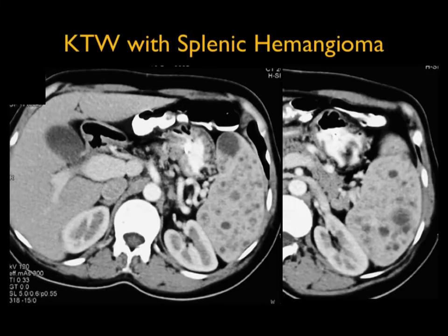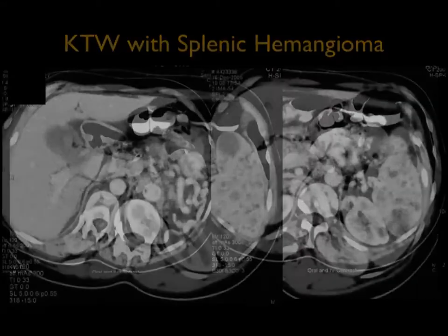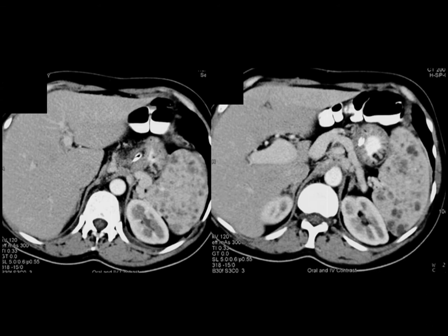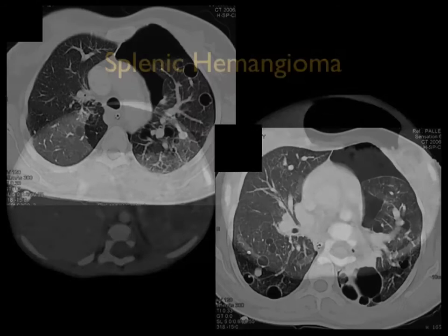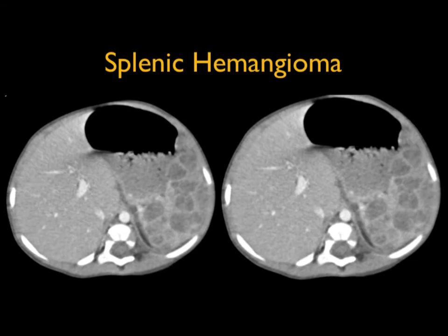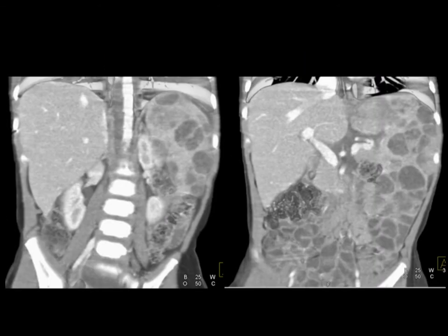Things like Klippel-Trenaunay-Weber, as in this case, can have multiple hemangiomas. The patients get cystic changes in the lung and spontaneous pneumothorax. You can also see splenic hemangiomas in another example of Klippel-Trenaunay-Weber where they replace a significant portion of the splenic gland — very minimal normal tissue is seen in this case, shown here on the coronal view.